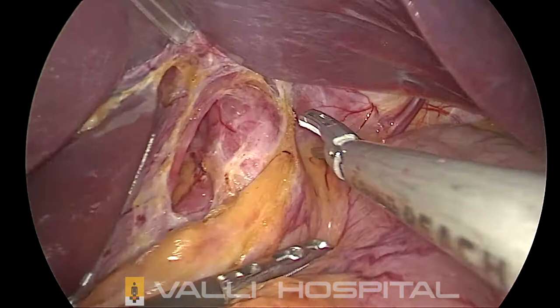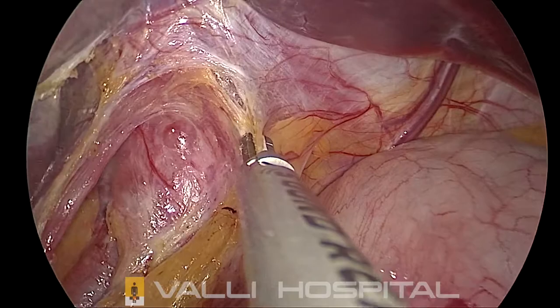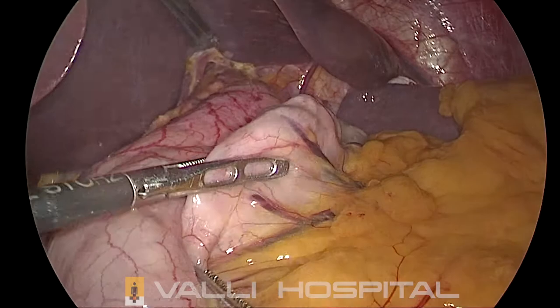Cutting a little bit on the left of the esophagus. Here you have to be careful about the anterior vagus. It is better done from the other side, from the left side.